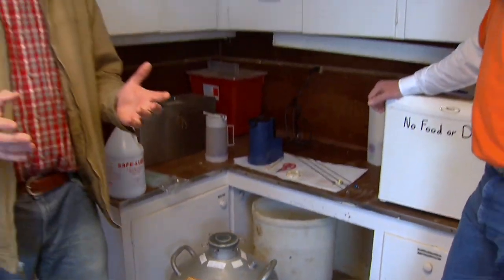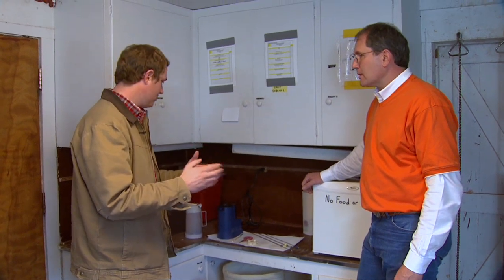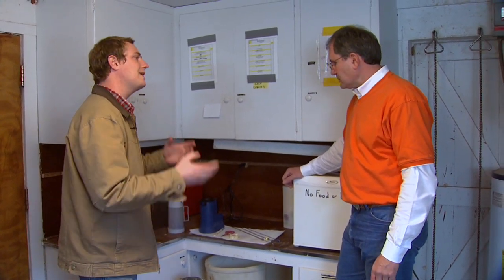We've taken a look at our cow herd and watched for estrus to find out if they're ready to be bred. We've talked about tank handling and the semen in the tank. Dan, why don't we go ahead and start with what do we do once we get it out?